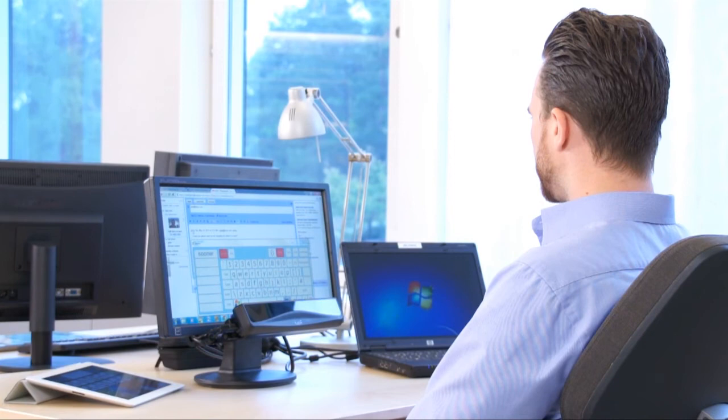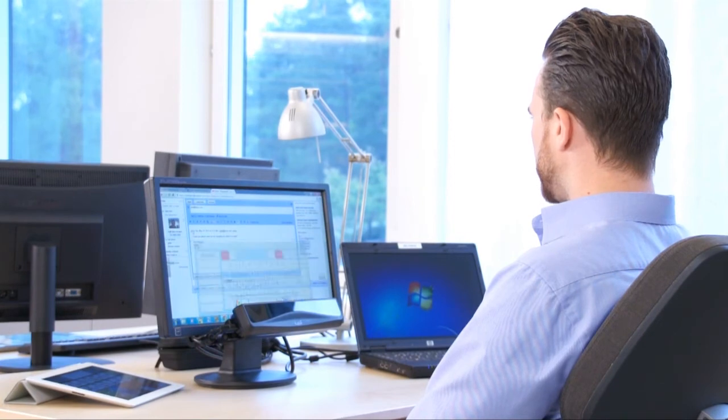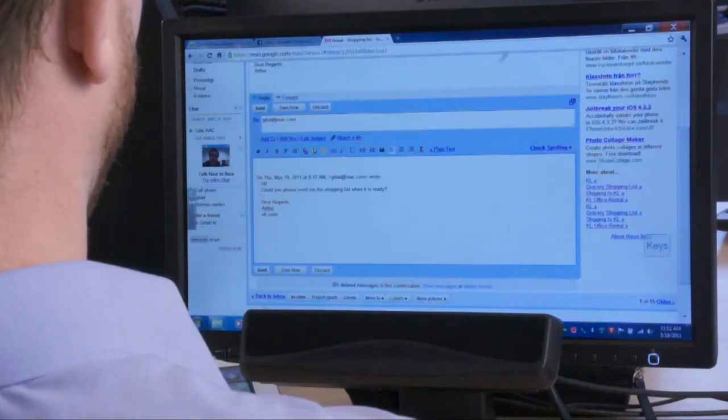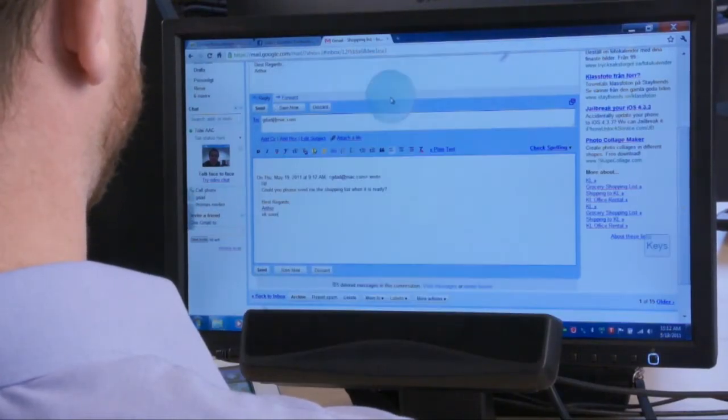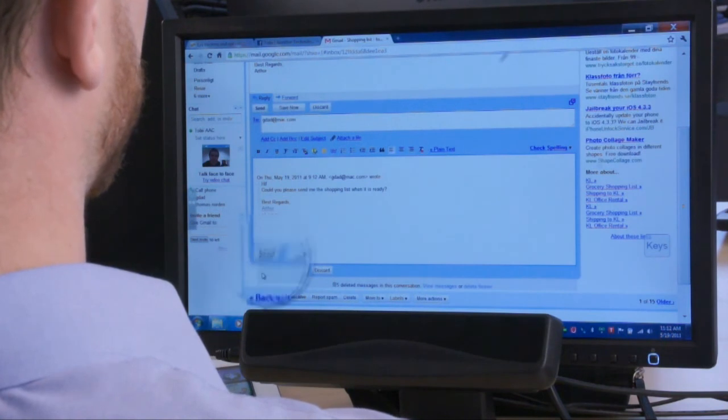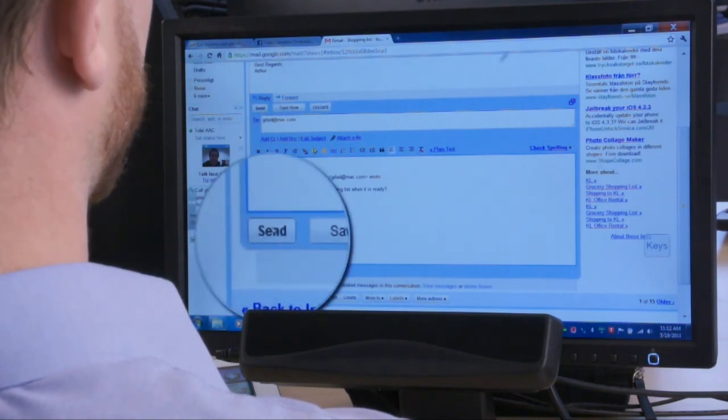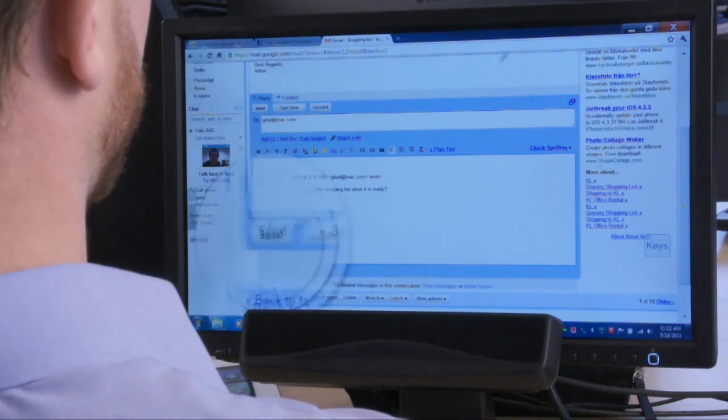If a button feels too small to click accurately, open up your minimized Windows Control menu and use your magnifying glass to magnify a small portion of the screen, then click there.